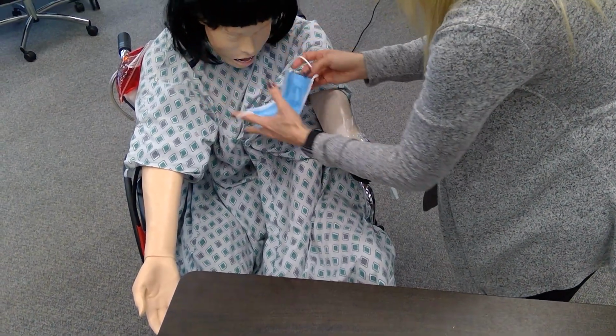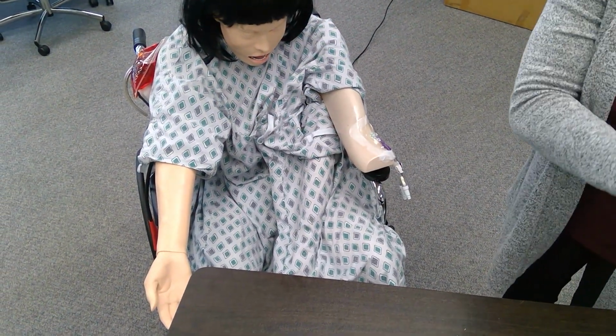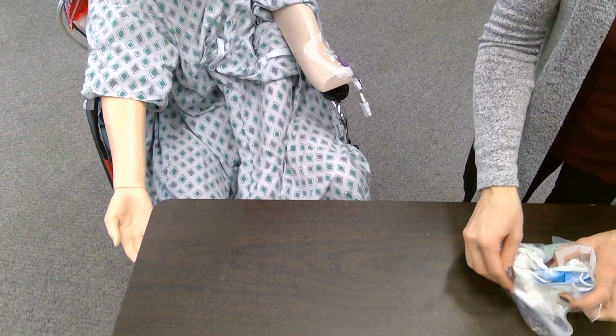I'm going to remove this mask. I'm going to throw away my stuff, my supplies, and then I'm going to wash my hands.